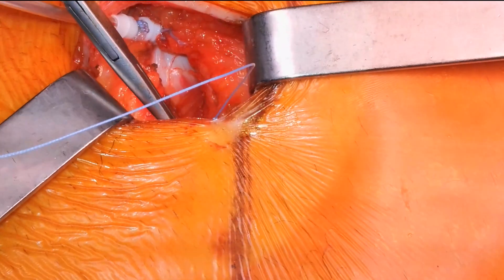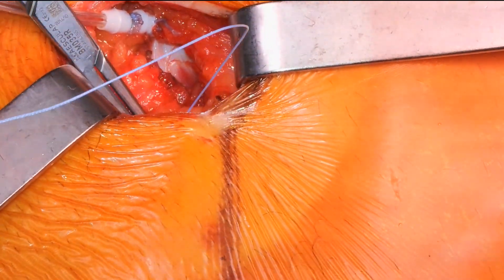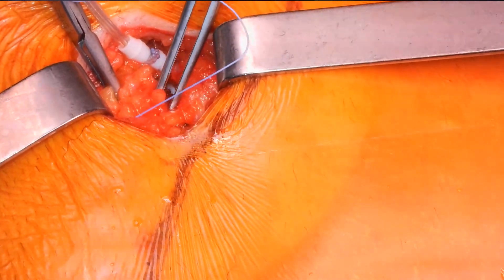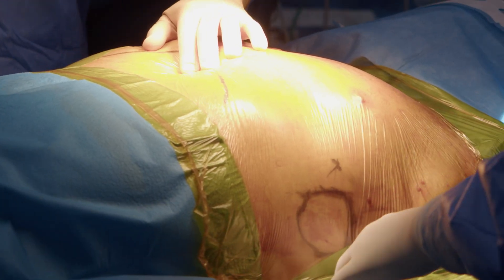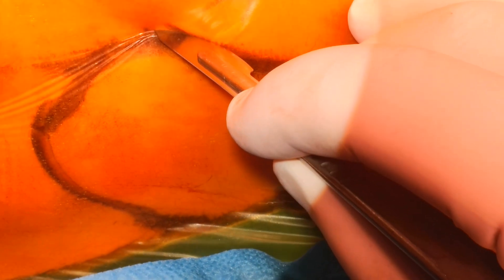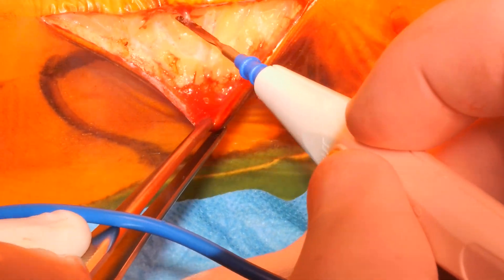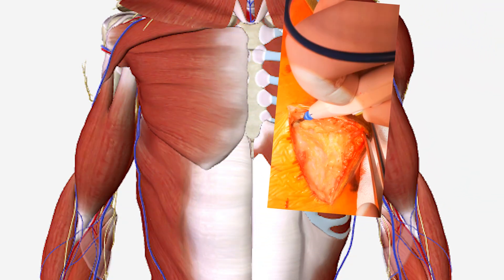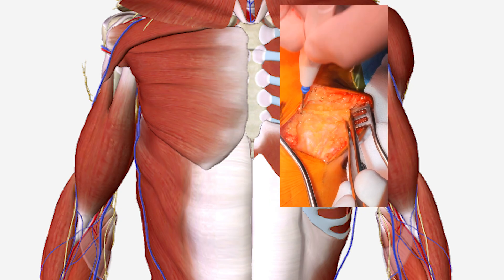Once proper functioning has been confirmed, we proceed to close the subcutaneous tissue and fascia. Next, we create a surgical pocket for the extravascular ICD generator on the patient's left side at the level of the left midaxillary line, underneath the skin and above the muscle fascia.